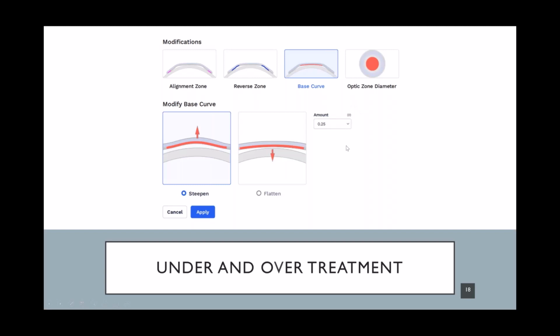You just know, oh, okay, I have the patient coming in at 8 o'clock in the morning and they're measuring at like a negative 0.5. Well, my target for them was really a +1, so I'm gonna have to change this by a diopter and a half.